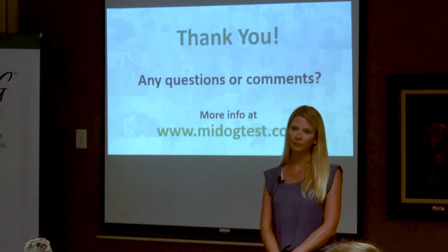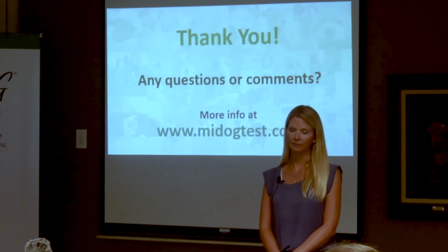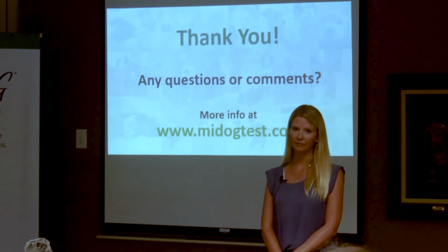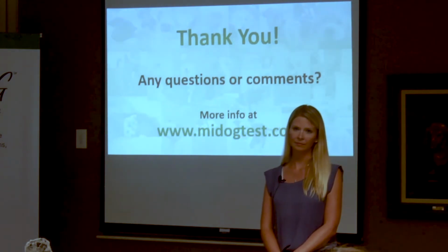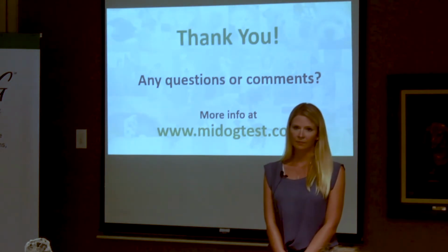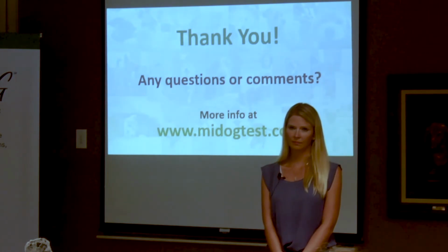And when you're doing it, are you still sending off the culture as well, just for a backup? No, I'm relying on it now. I just sent 2 samples in the other day, and both matched my cultures. That's what I'd be thinking too. Now I'm trusting it, I've done enough cultures versus sequencing that I've seen that they're extremely compatible. What I'm seeing is they're exactly the same, except the sequencing is giving more information and more data, and finding things that the culture's not.